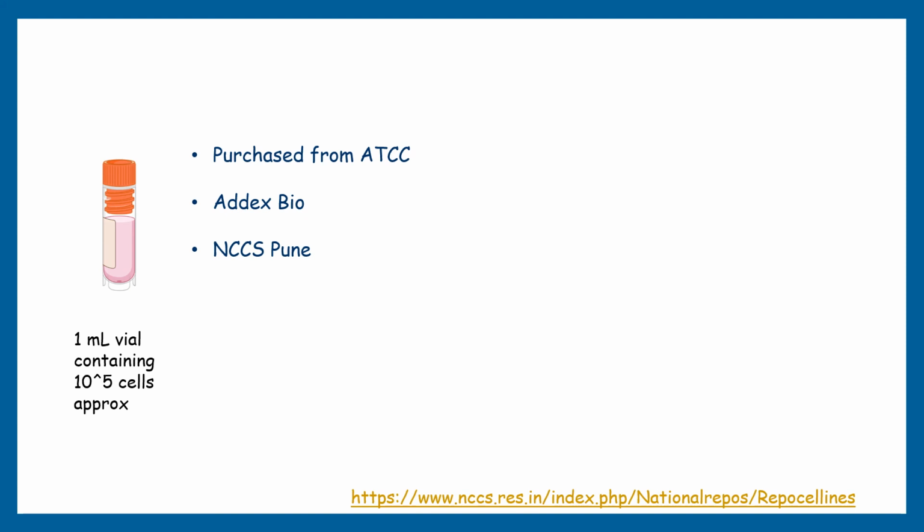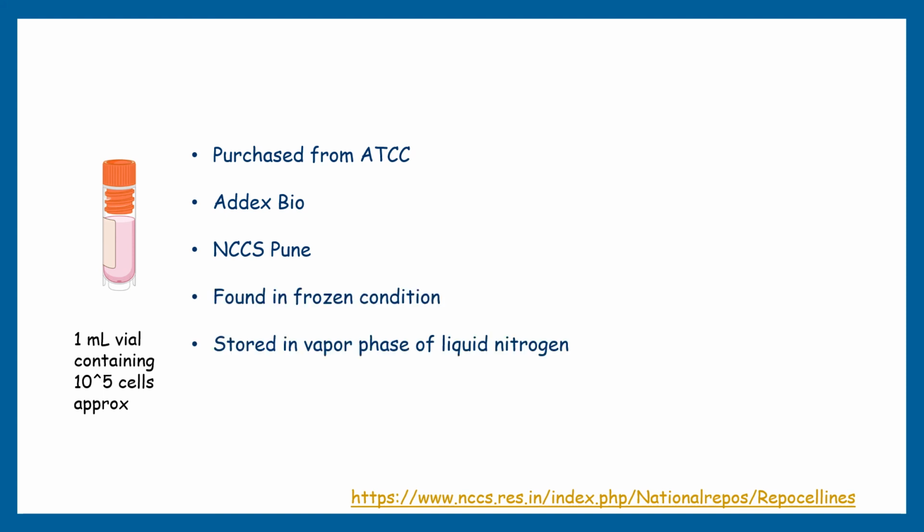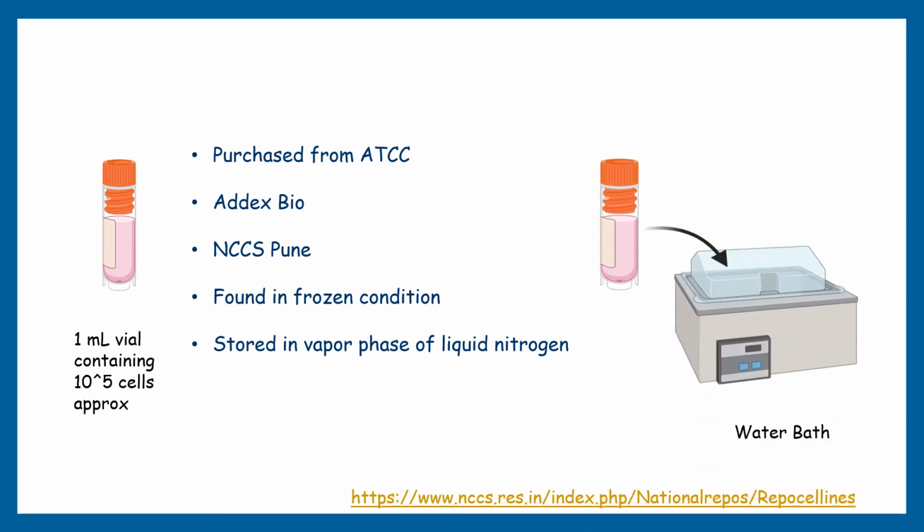Once you order, mostly they will deliver it in frozen condition packed with dry ice. To ensure the highest level of viability, thaw the vial and initiate the culture as soon as possible upon receipt. To initiate the process, thaw the vial by gentle agitation in a 37 degrees Celsius water bath. Keep the o-ring and cap out of the water to reduce the possibility of contamination.